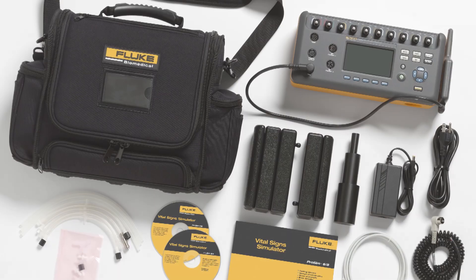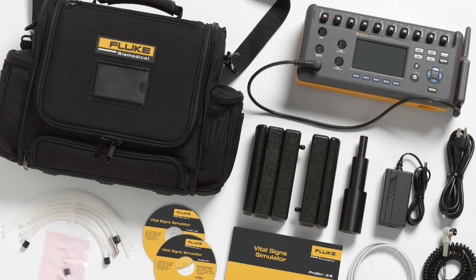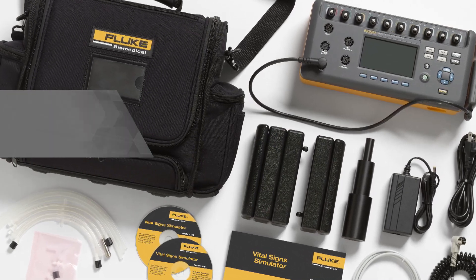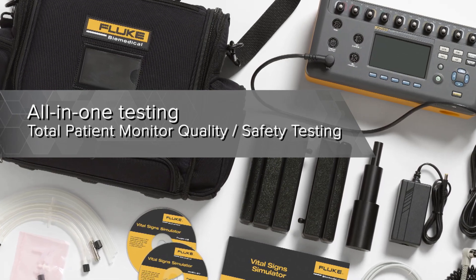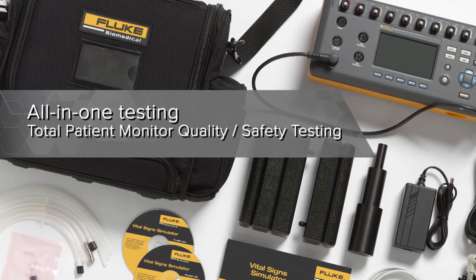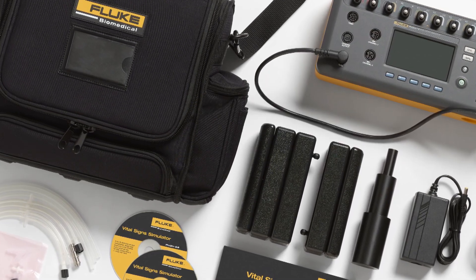Get the ProSim 8 Multifunction Vital Sign Simulator to ensure your devices provide the ultimate in patient safety. Reduce your testing time with this all-in-one tester. Integrated auto sequences, onboard memory, and a nine-hour battery life allow you to test all day long. No extra modules are needed.